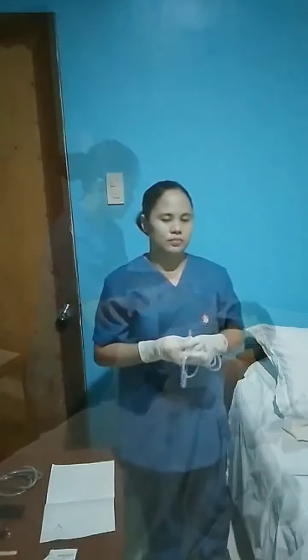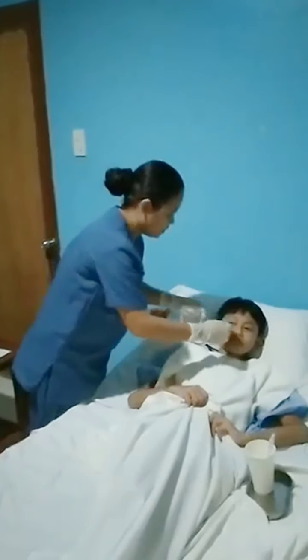After putting on our gloves, the next thing to do is to determine how far the tube is going, or to measure the length of our nasogastric tube. And that is by measuring the tip of the nose to the tip of the earlobe and also connecting it to the xiphoid process. That will help us approximate the desired distance of our tube.